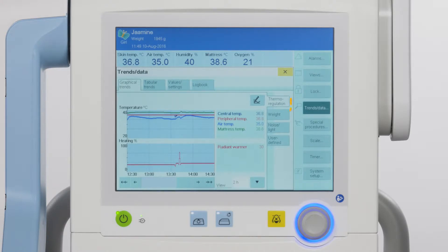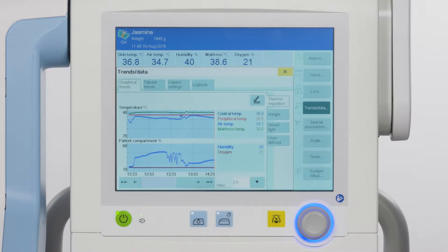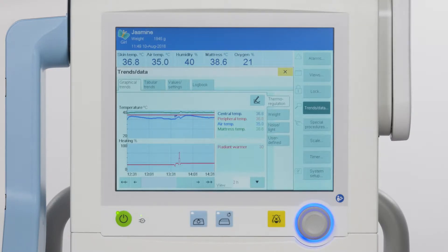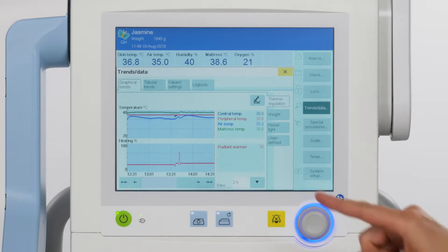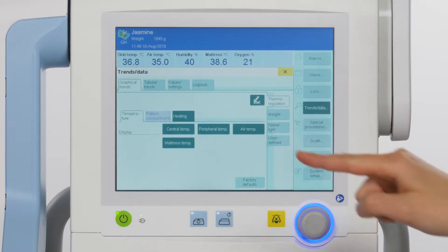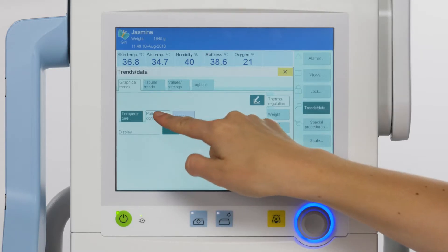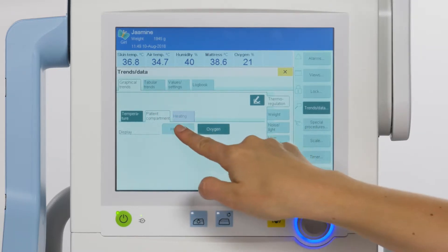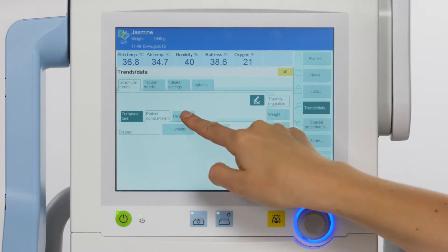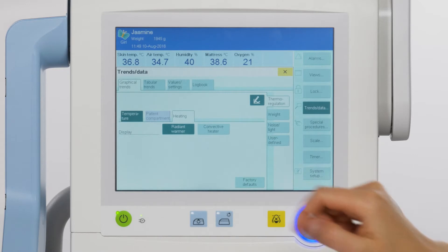Parameter groups can be selected using the vertical tabs, including parameters such as thermoregulation, weight, noise and light, as well as user defined. In thermoregulation, a maximum of two overviews may be displayed at the same time — for example, temperature and patient compartment, temperature and heating, or patient compartment and heating. Touch the pen icon to change the overviews. Dark green means the parameter is selected and displayed as a graphical trend. Light green means the parameter can be selected. Gray means the parameter cannot be selected.